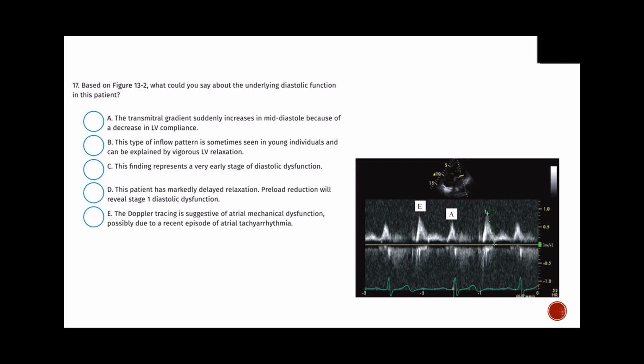So does this look like, what kind of diastolic dysfunction do you think this is? Grade normal, grade 1, grade 2, grade 3? Grade 2, also known as pseudonormalization. Why do you say that? Because it looks like a normal pattern. Yeah, but so why would it be normal? Looks normal, but it appears delayed. So what we see here is that there's a shorter isovolemic relaxation time, but that's just by gross visualization. Your deceleration time here, which is highlighted, right, is very rapid. So that would be more consistent with pseudonormal versus normal, right?